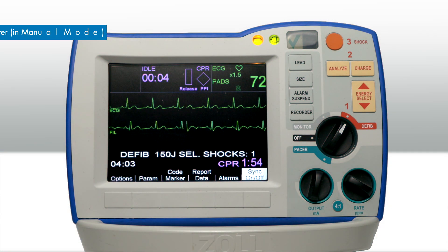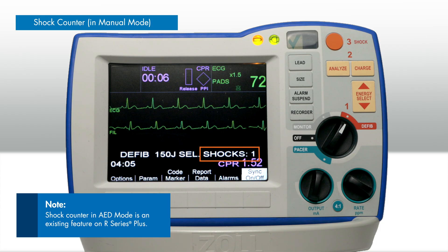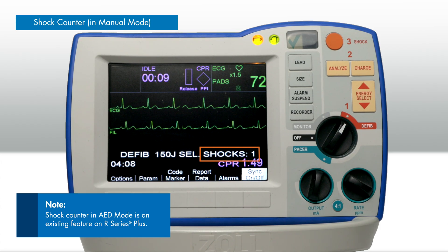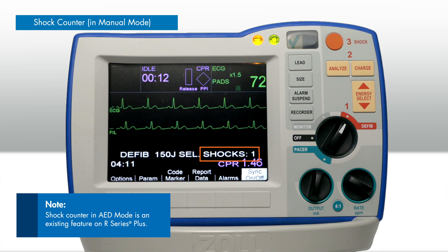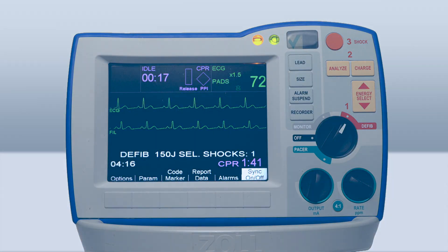A new shock counter can now be added to the screen when the R-Series ALS or R-Series Plus is in manual mode, allowing users to easily view the current number of shocks provided to the patient.